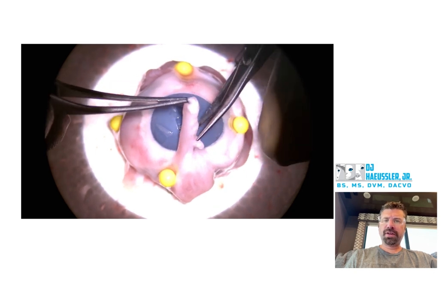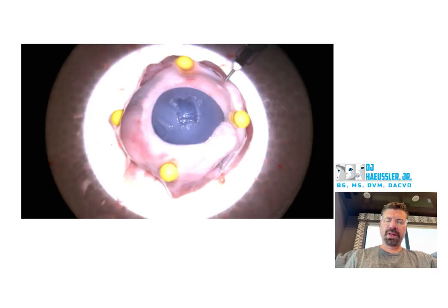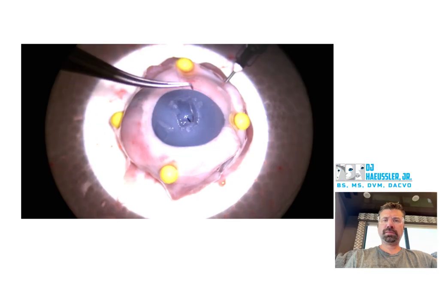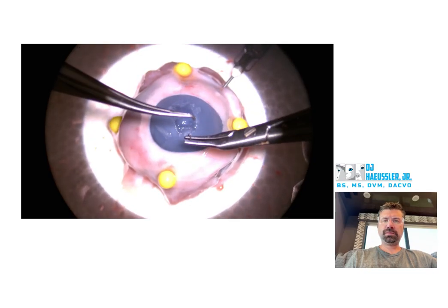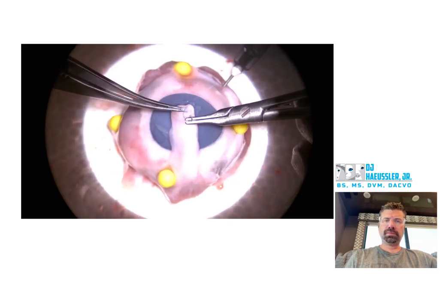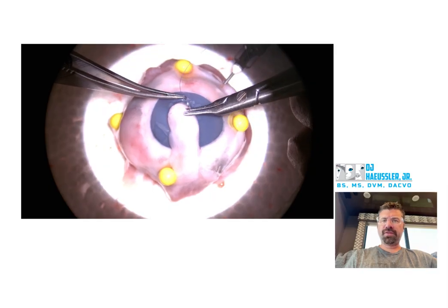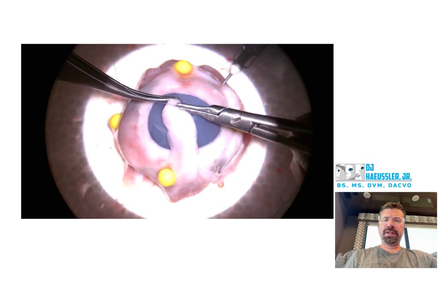So pretty wide graft there, a lot wider than you need to be, but I see you're going to work some of that down, which is okay. Good job tucking it off to the side. Your graft is pretty thick at this point — I'm sure you're going to thin it down. Good job rolling there.